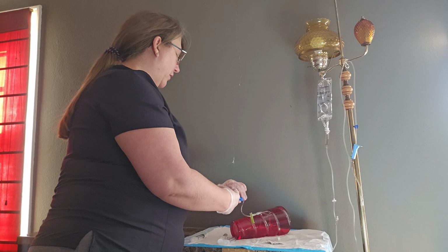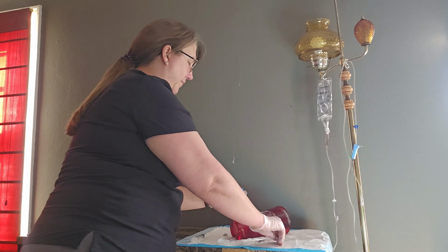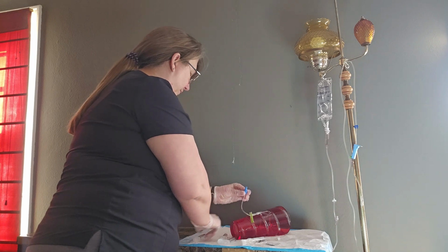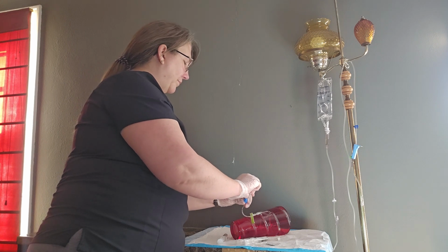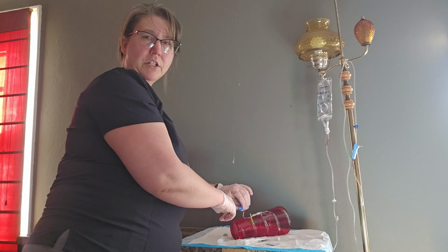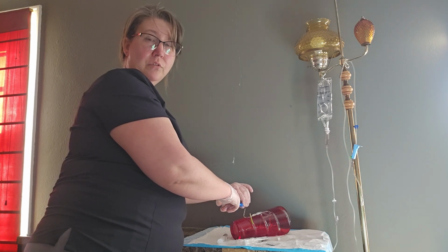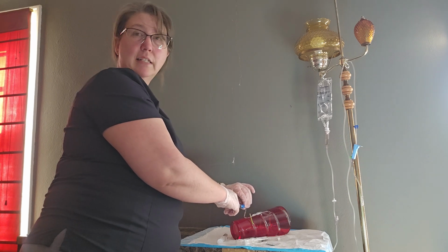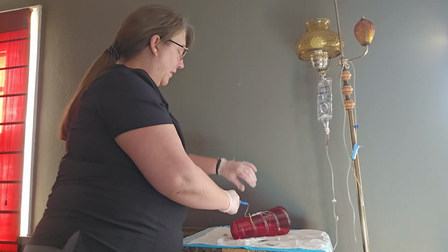And when that minute's over, I'm going to put it down, scrub the hub again, and allow it to dry. And then I'm going to take my other saline, attach, and this time, with my second flush, I am going to flush the second saline into the J-loop at the same rate as I did my medication. In our example, I said it was 1 minute for the medication, so it's going to be 1 minute for the second flush of saline.